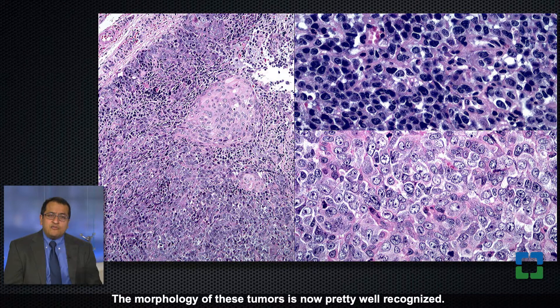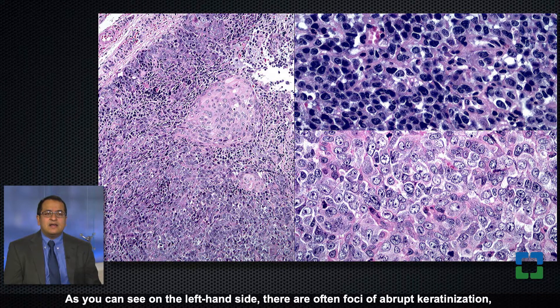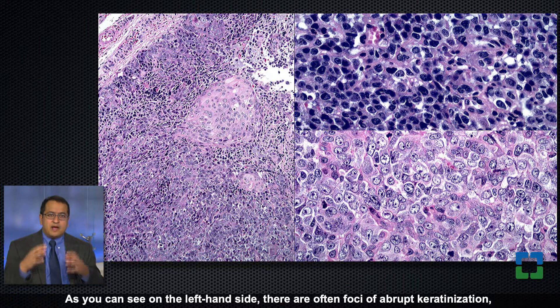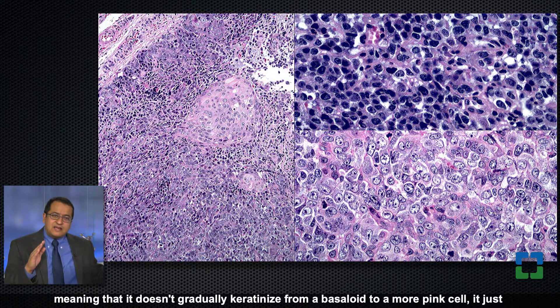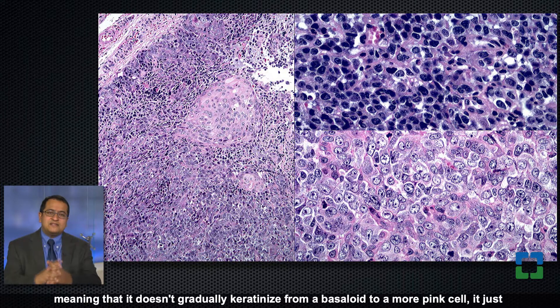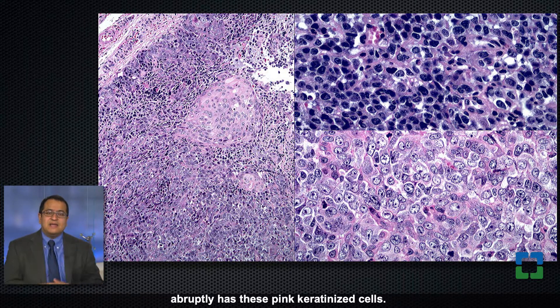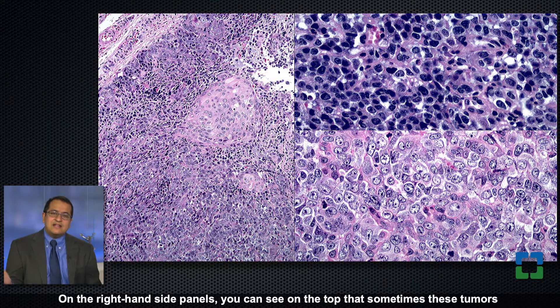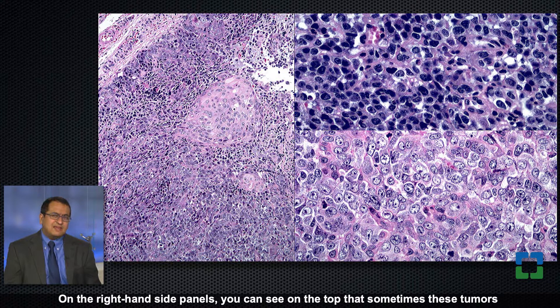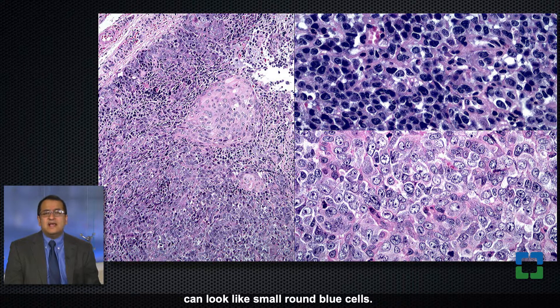The morphology of these tumors is now pretty well recognized. As you can see on the left-hand side, there are often foci of abrupt keratinization — meaning it doesn't gradually keratinize from a basaloid to a more pink cell, it just abruptly has these pink keratinized cells. On the right-hand side panels, you can see that sometimes these tumors can look like small round blue cells.